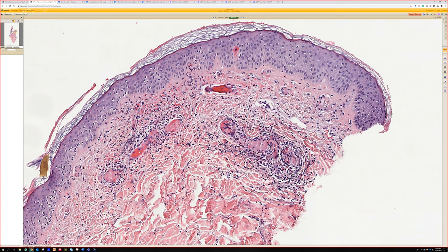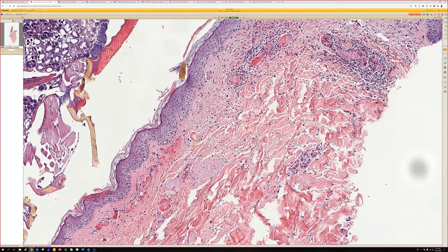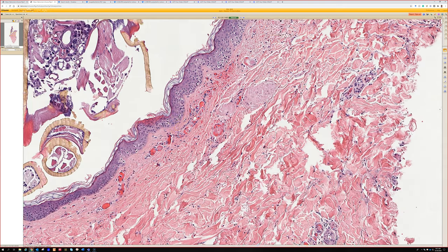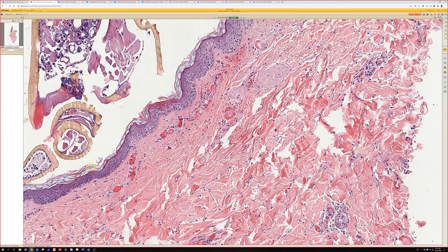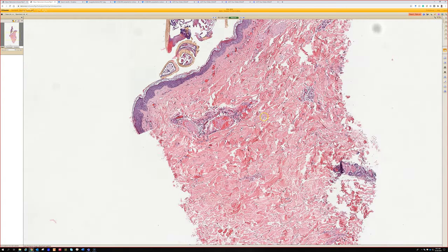My partner Sarah first picked that up on a biopsy of a kid — she saw fibrin thrombi and thought maybe this kid has a coagulopathy. But the kid had scabies — they just didn't see the organism. She then started looking at other cases and lo and behold, fibrin thrombi are present under scabies pretty often. So it's a nice little clue. This is a lot of fibrin thrombi underneath this tick bite.